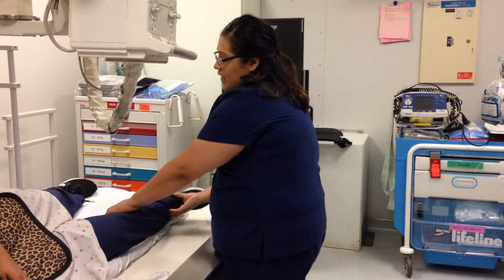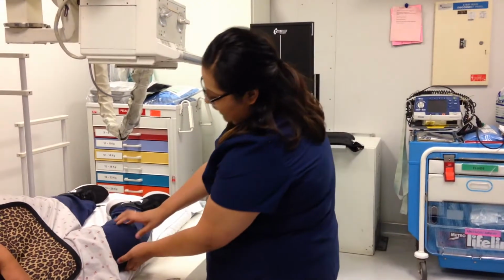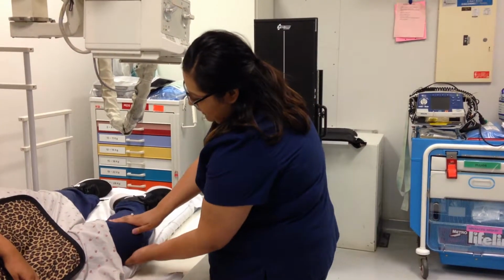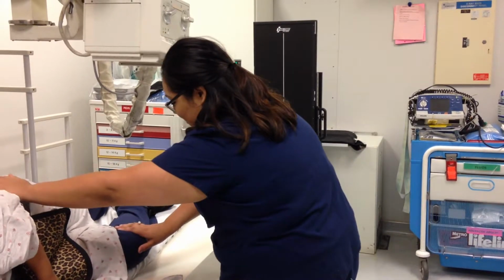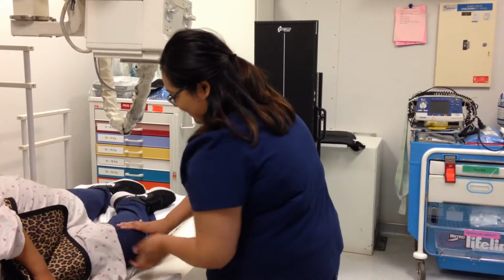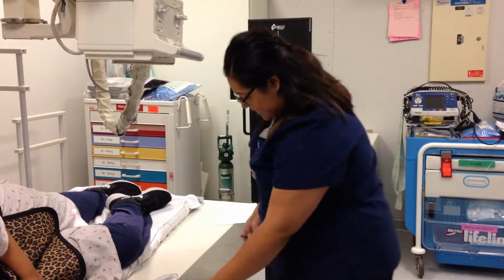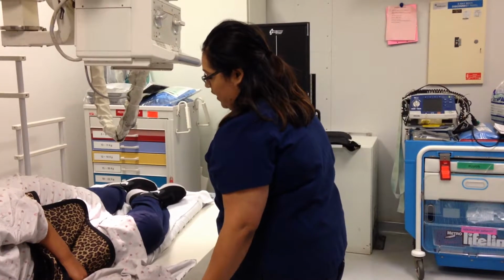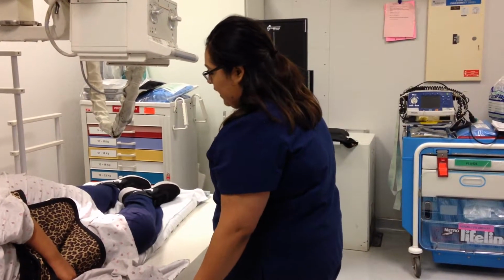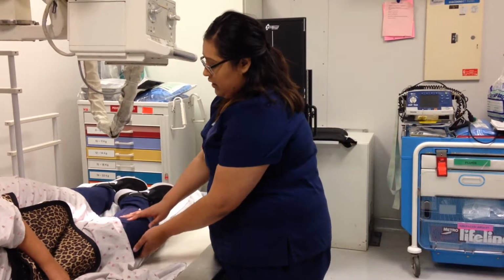And then we want the knee here flexed 20 to 30 degrees, as so, making sure our epicondyles are nice and perpendicular to the IR, and making sure patella is perpendicular as well. And for the central ray, for the lateral knee, we want a central ray 1 inch below the medial condyle.